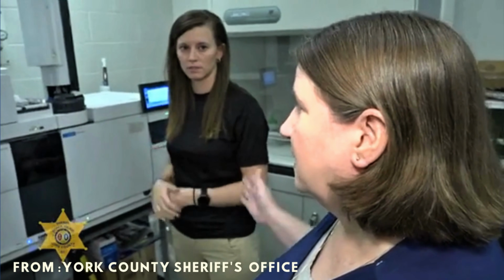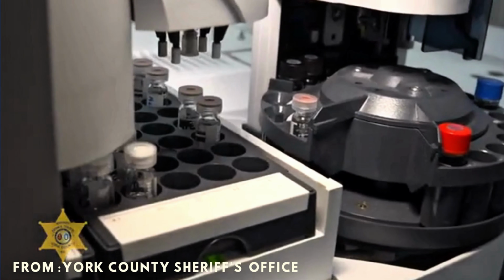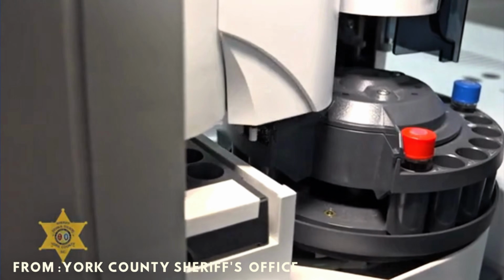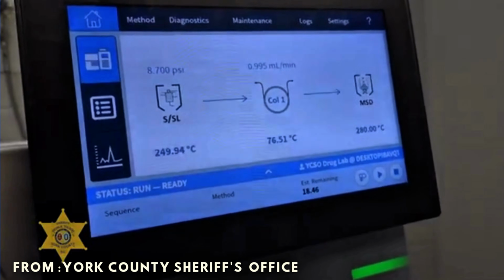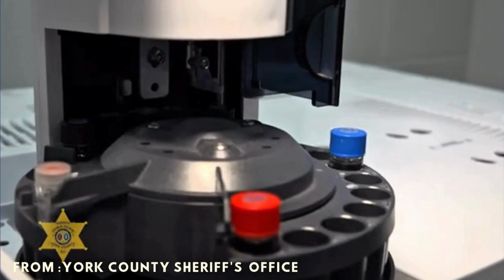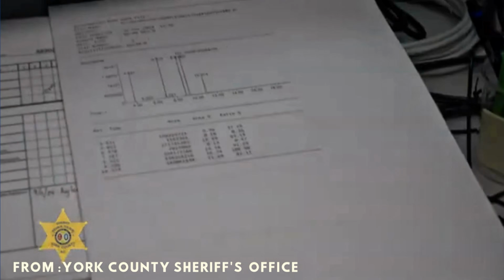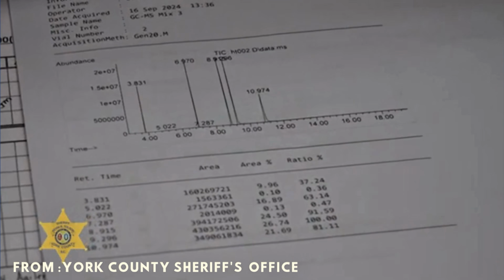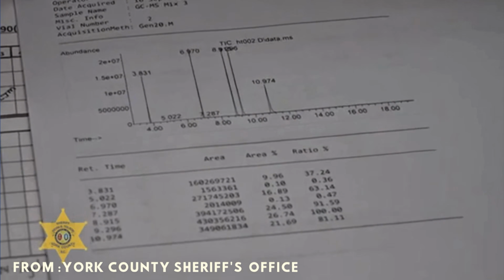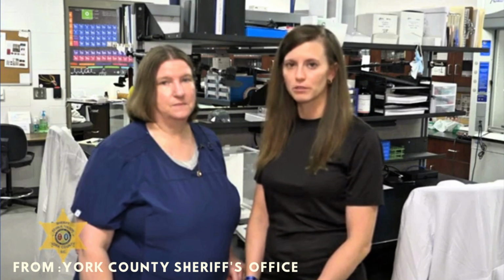So then once she's extracted it, it goes into one of the vials on the instrument, and this instrument is called a gas chromatograph mass spectrometer, GC mass spec for short, and we get our results from it so we can look at the end results. And this is an example of the results we would get out, and then we would go in and look at each individual peak and determine if it's something that is controlled or not controlled. And through this process, we will create a report and send that to the investigating officer. From there, the investigating officer will continue the case, and if it needs to go to trial, we will go and testify on our results.